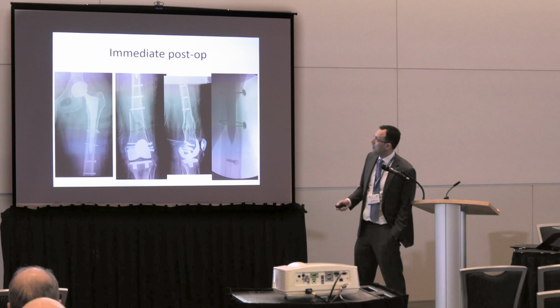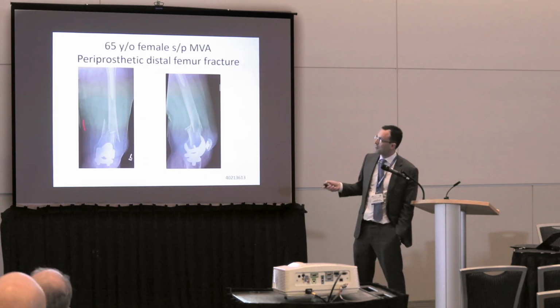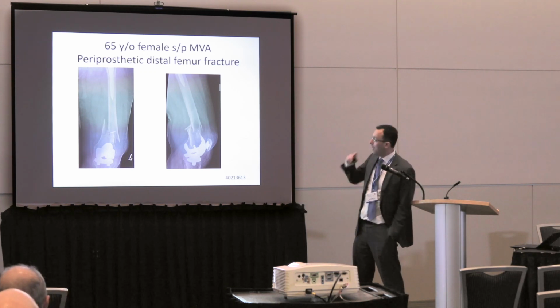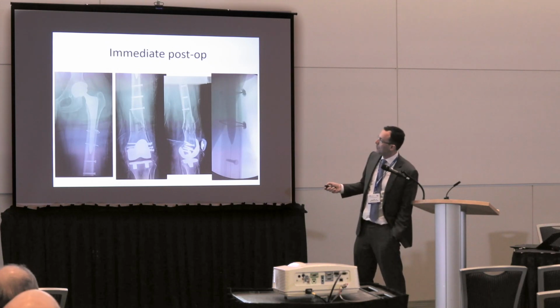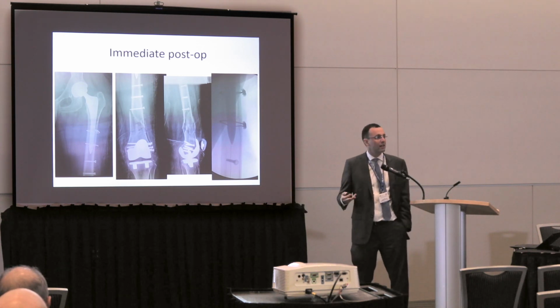65-year-old, same story. What I wanted to show you here is this was one of these interprosthetic fractures that we, again, are seeing more and more of. I didn't hesitate with this implant there. As you can see, no surprise at how one fixed it, I think what I wanted to highlight is the fact that cerclage wires can be applied to this implant again without any difficulty.